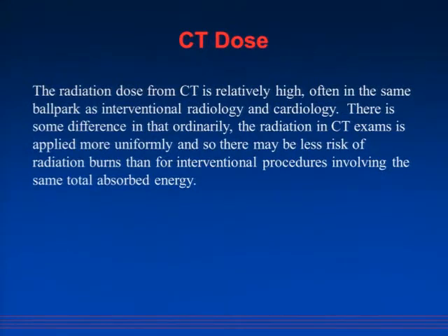CT dose. The radiation dose from CT is relatively high, often in the same ballpark as interventional radiology and cardiology. In many cases, that's come way down. There is some difference in that ordinarily the radiation in CT exams is applied more uniformly, and so there may be less risk of radiation burns than for interventional procedures involving the same total absorbed energy but focused in a smaller region. There have been some exceptions, but those have generally been mistakes.